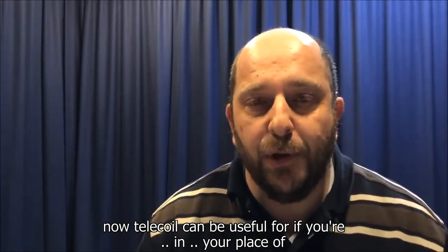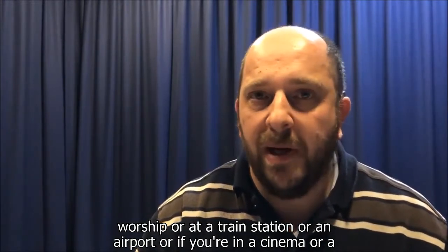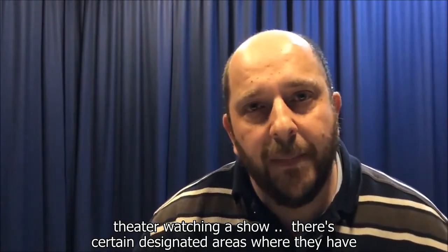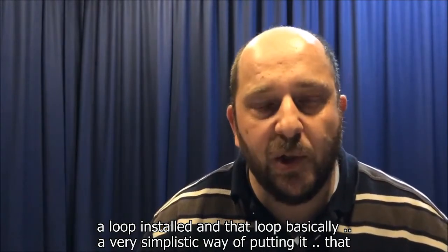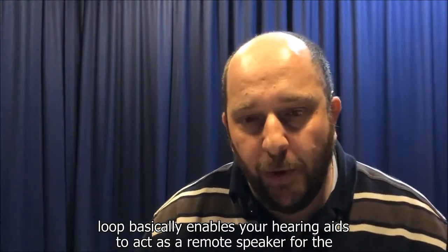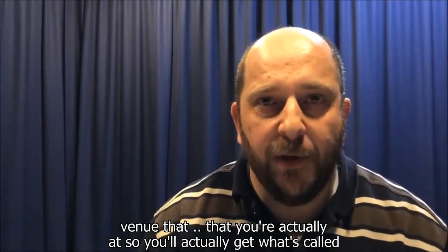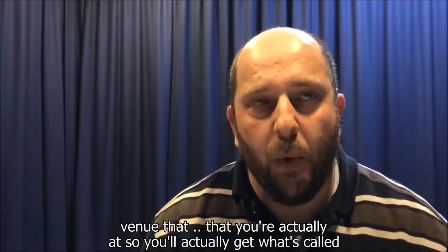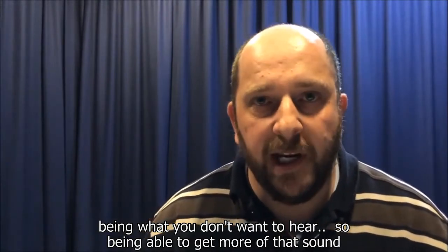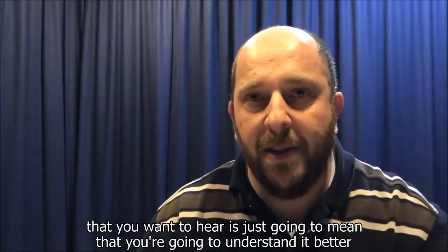Now, telecoil can be useful if you're in your place of worship, or at a train station or an airport, or in a cinema or a theatre watching a show. There are certain designated areas where they have a loop installed, and that loop, in a very simplistic way of putting it, enables your hearing aid to act as a remote speaker for the venue that you're at. So you'll get what's called a better signal to noise ratio, signal being what you want to hear, noise being what you don't want to hear. Being able to get more of that sound that you want to hear is just going to mean that you're going to understand it better.